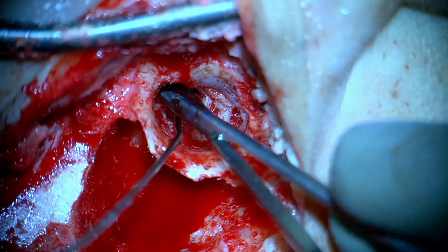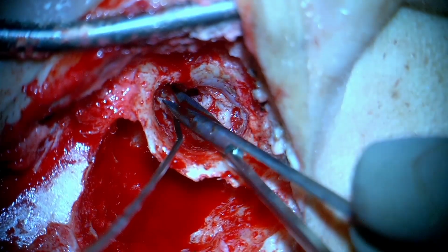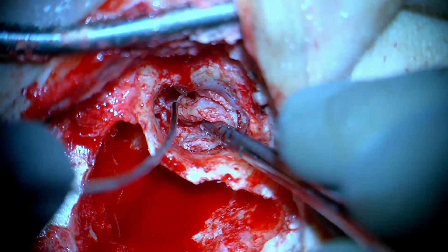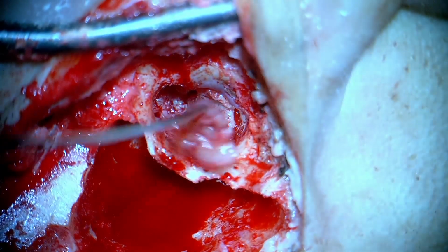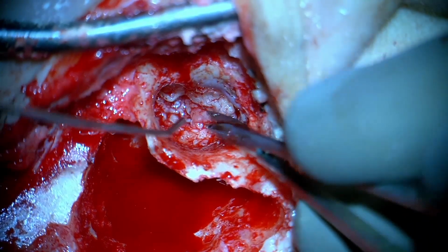We would not like to pull onto anything, because that creates significant traction, can demucosalize the middle layer, which is detrimental, or, if these are attached to the ossicles, dislocate them as well.